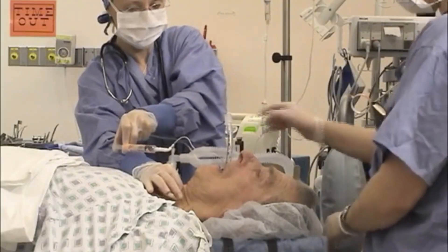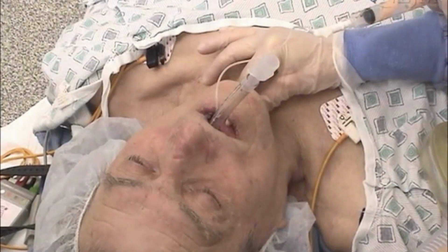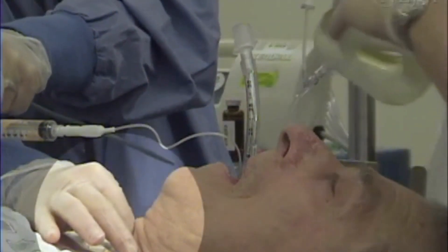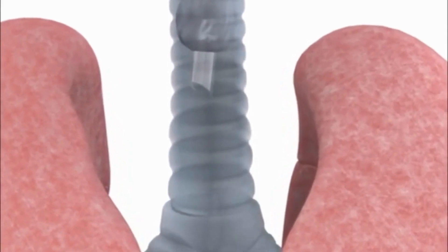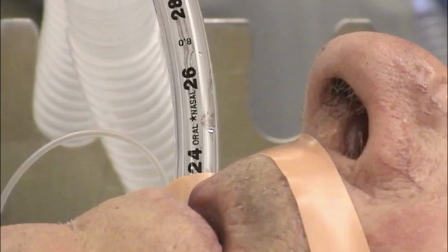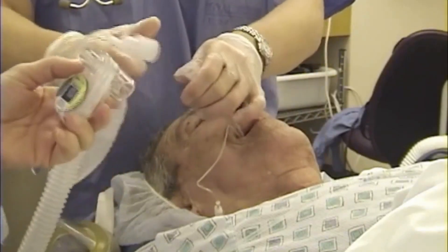Inflate the endotracheal balloon with air to the minimum pressure required to prevent air leaks during tidal volume ventilation with a bag; this usually requires less than 10 cc of air. The assistant must maintain cricoid pressure until tube placement in the trachea is confirmed. The end of the endotracheal tube should lie in the mid-trachea, 3-7 cm above the carina. A good rule of thumb is 22 cm at the teeth for the average-sized adult.